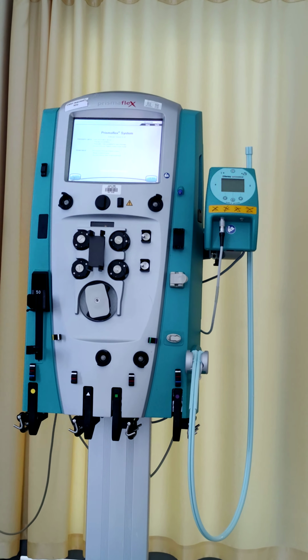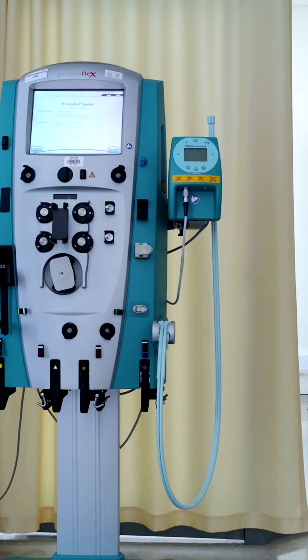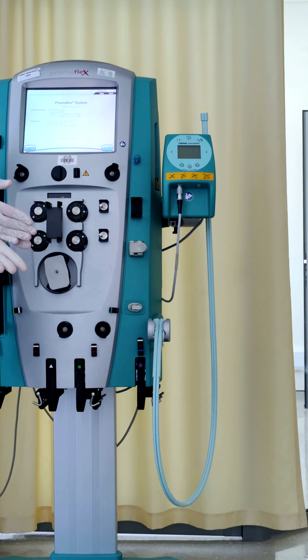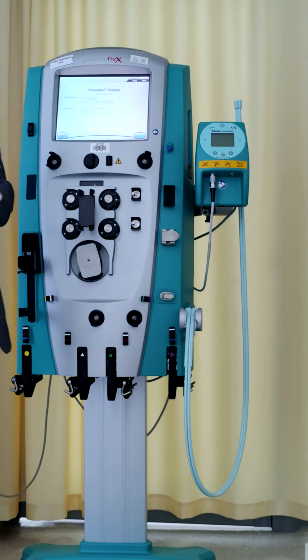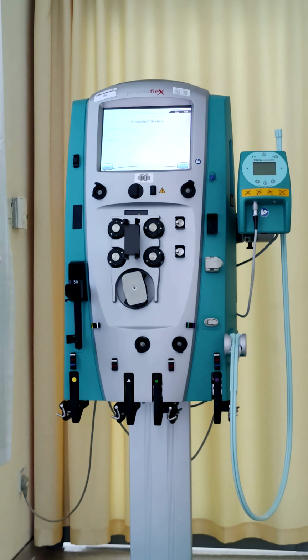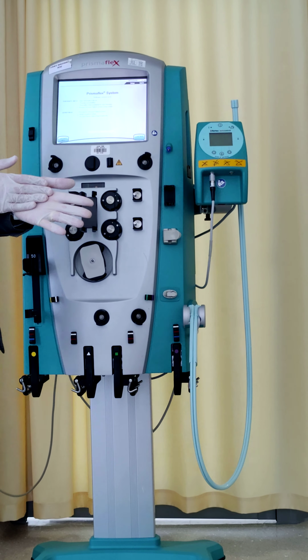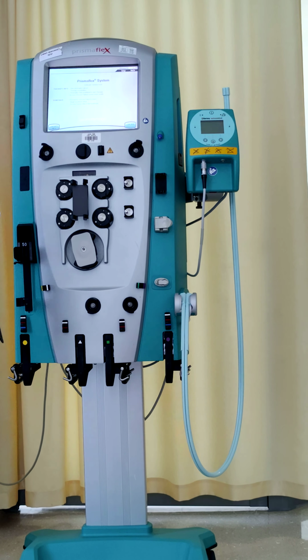Some hospitals do 1-1-1: 1 liter plasma, 1 liter albumin, 1 liter saline. Okay, so I can divide this 3 liters. Yes, it depends on the patient. Sometimes half plasma, half albumin. And usually we use 5% albumin.